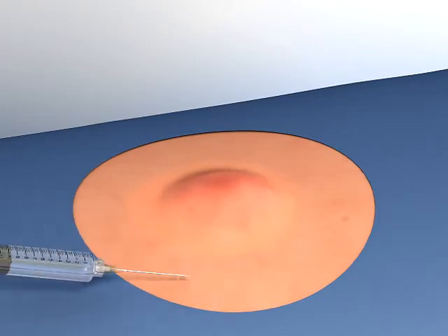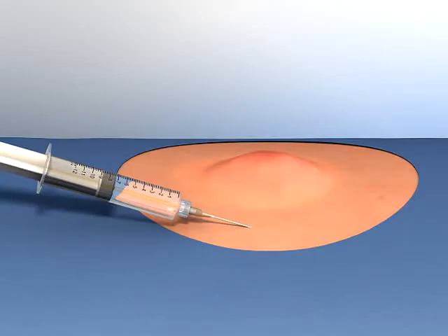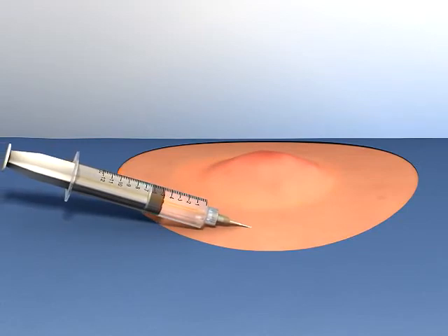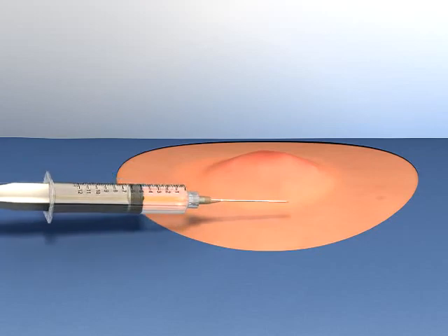Advance a long needle through the wheal and begin to anesthetize the perimeter of the region. Intermittently, pull back on the plunger to exclude intravascular placement. Continue to anesthetize the entire perimeter, taking care to insert the needle in regions already anesthetized.